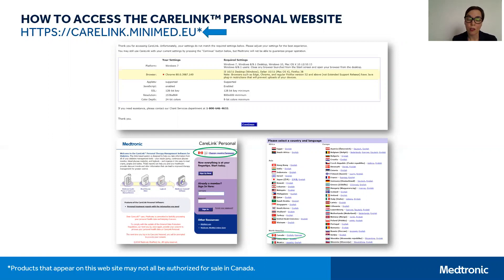Once on the CareLink Personal Software page, you want to ensure that your country and language of choice are appropriate. If they're incorrect, simply click on Change Country or Language as outlined here in green, and choose your appropriate country and language of choice.